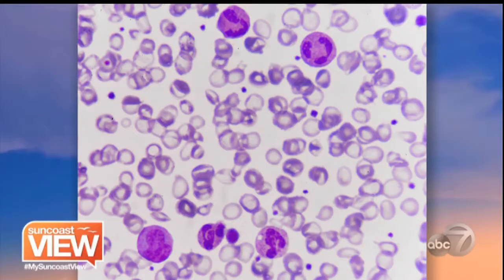We get a little finger prick. So we do a lancet, and then we pop it right on the slide, and then from the slide on the microscope, it projects it on the screen. So then the patients actually get to see exactly what we're looking at. Oh. So they get to play chemist, biologist, microscopist. So like this slide is showing what?